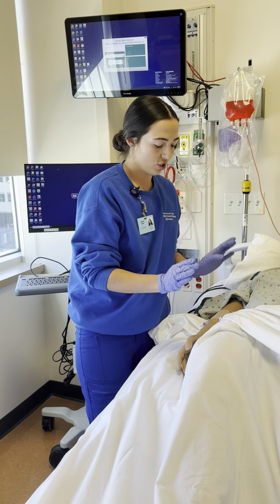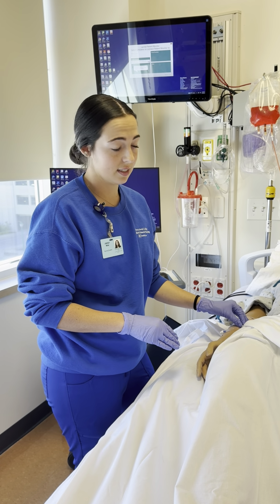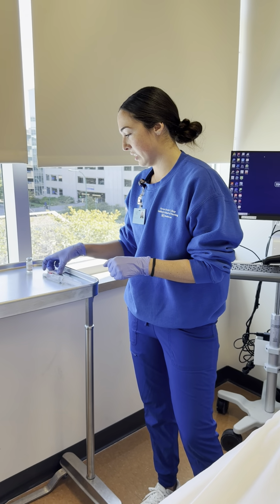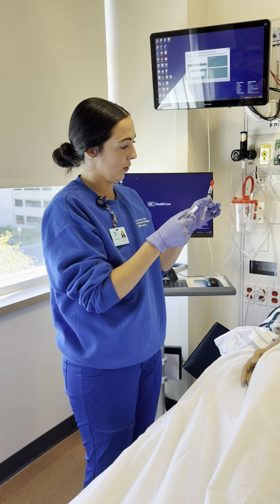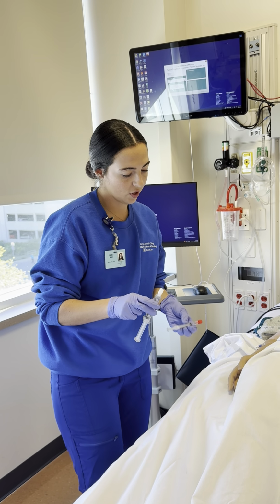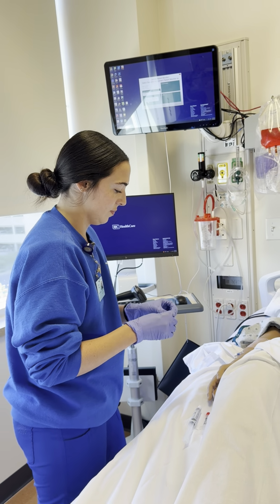So I'm going to make sure to look at the IV side, make sure that everything's ready. So it looks like this is locked here. We've got our hub, and we're going to go ahead and get everything ready to go. So I've already drawn up my medication, 20 milliliters here. I've made sure that there are no air bubbles, and it looks great. And I've got my sterile flush. So, okay, IV, whenever you are ready, we're going to go ahead and get started.